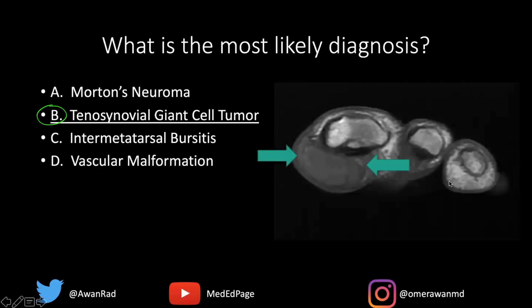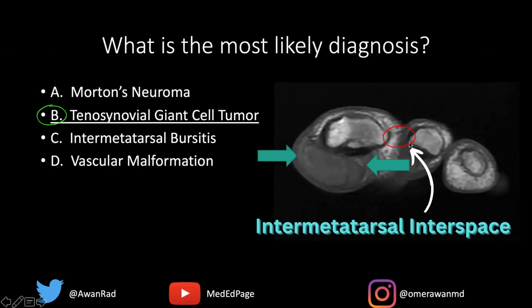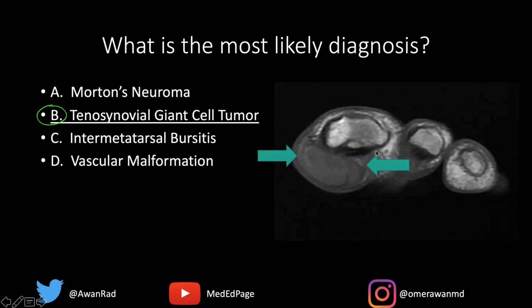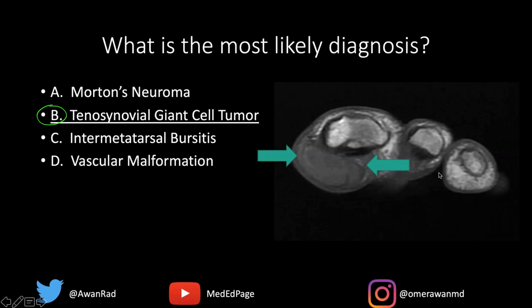This is not a Morton's neuroma, because Morton's neuroma would be in the intermetatarsal interspace — in the space between the metatarsals. Furthermore, it would be plantar to the intermetatarsal ligament. If we draw an imaginary line between the flexor tendons of one digit to the flexor tendons of another, Morton's neuroma would be plantar to that ligament.